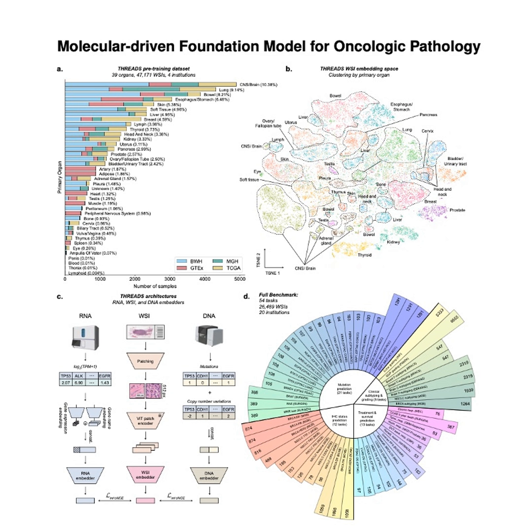And the researchers themselves pointed out something interesting in their analysis about where the benefits are greatest, didn't they? They did. They noted that just scaling up the size of the pre-training data doesn't seem to provide huge benefits for relatively simple visual tasks like basic tumor grading. The models were already pretty good at that. But they found that for the most complex problems, like predicting treatment response or inferring subtle molecular states directly from the image, that's where scaling up the data diversity and especially leveraging that multimodal molecular guidance offered the largest performance gains. So the complexity of the guidance matches the complexity of the task.